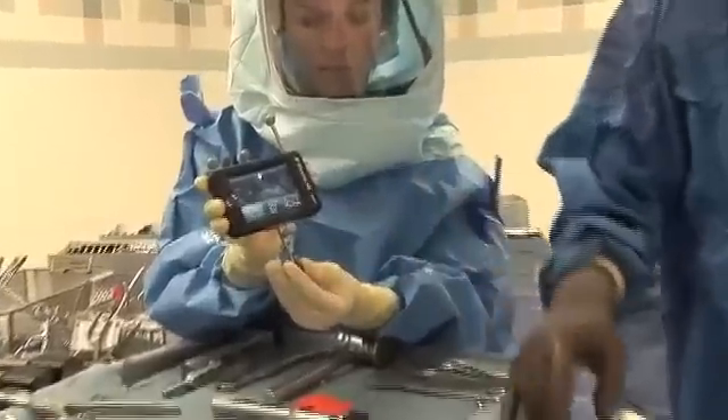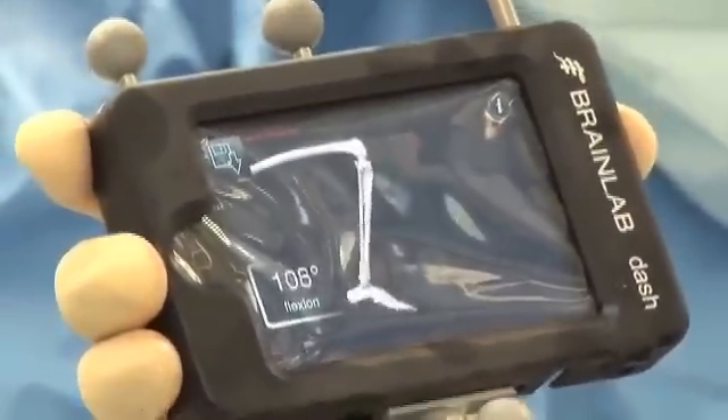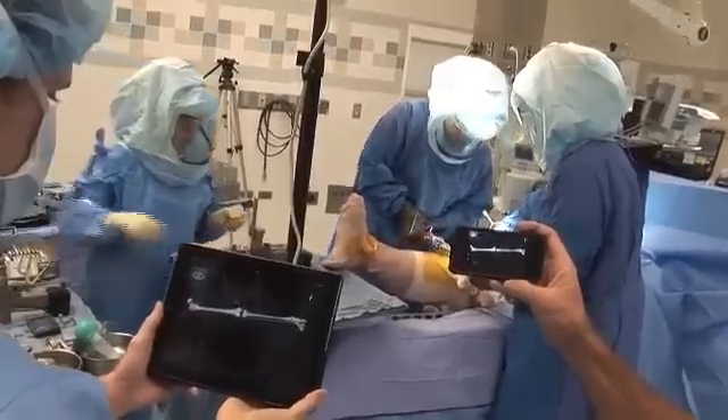I'll be taking the knee through a range of motion, and it's going to tell me exactly how far it straightens, how far it bends, and if it's too loose or too tight. Using this technology, I'm able to control everything myself and really make the knee go in much better, with the potential to have less pain, less bleeding, better range of motion, improved outcomes, and a knee that lasts longer.